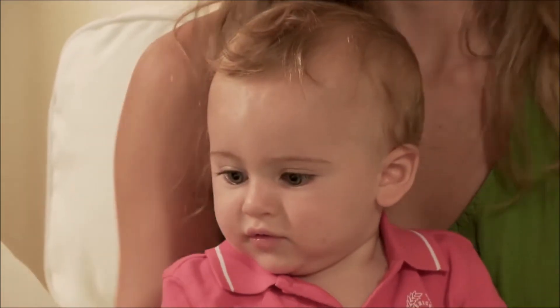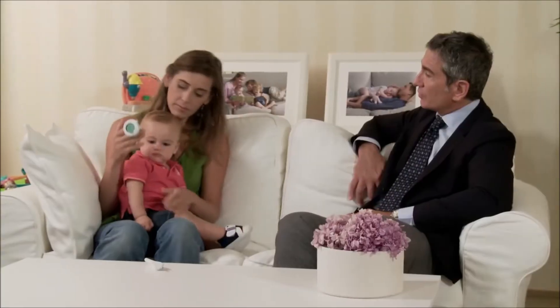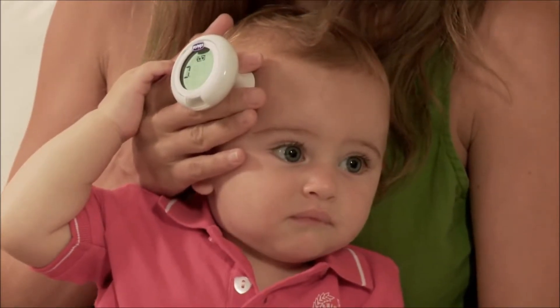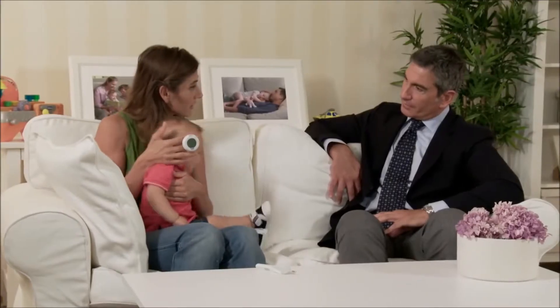Those that take the temperature on the temple are a little simpler to use because you just have to put the sensor on the forehead of the child above the eyebrow, wait a few seconds, and then the thermometer will give you the temperature. It is easy. Of course.